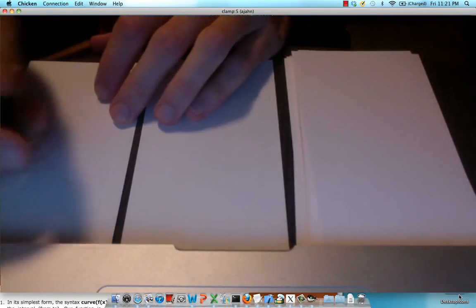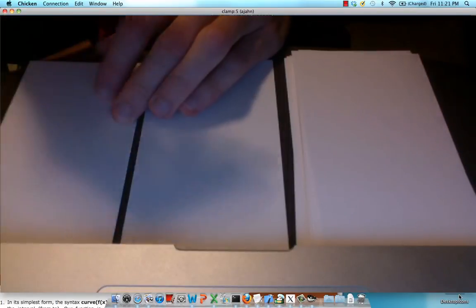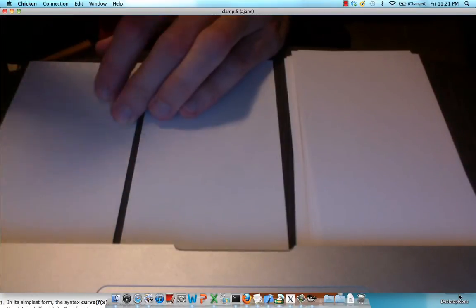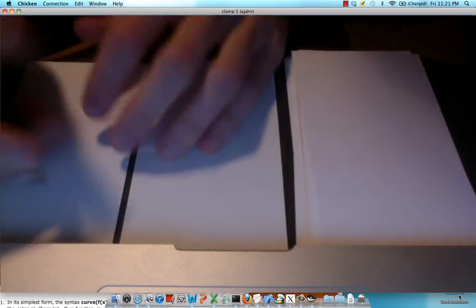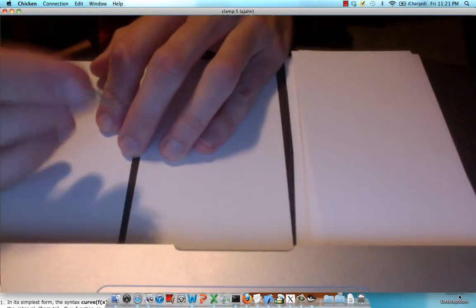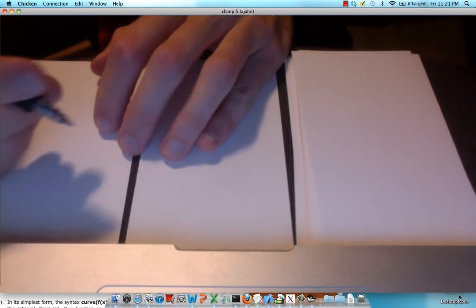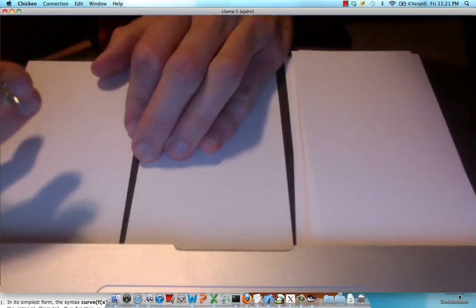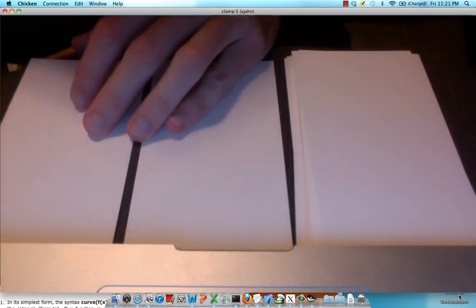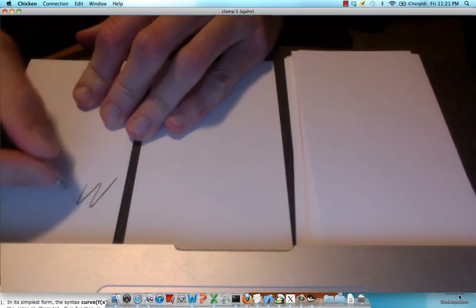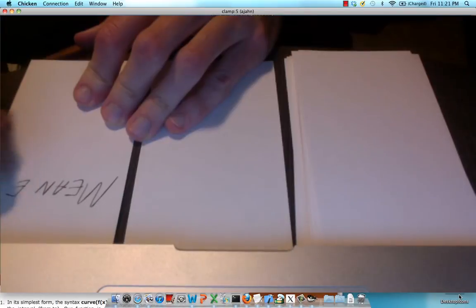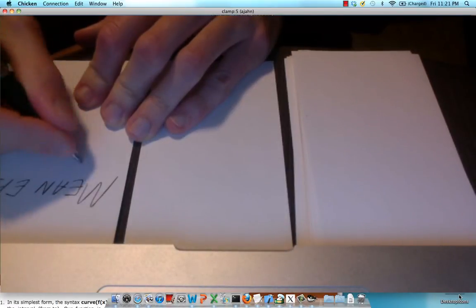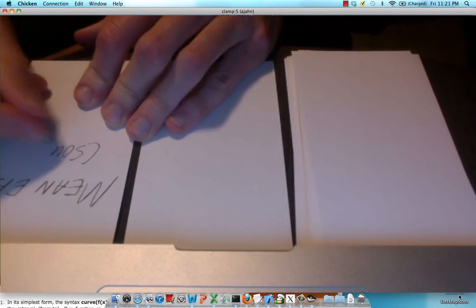So what SPM needs is it needs what's called a source image or something that's going to remain stationary for the other images to be aligned to. So usually you either use the functional image that was acquired closest in time to your anatomical image, or you take a mean of all your functional images. In this case, let's assume that we take a mean EPI or mean functional image. So this is our mean EPI and it is our source image.